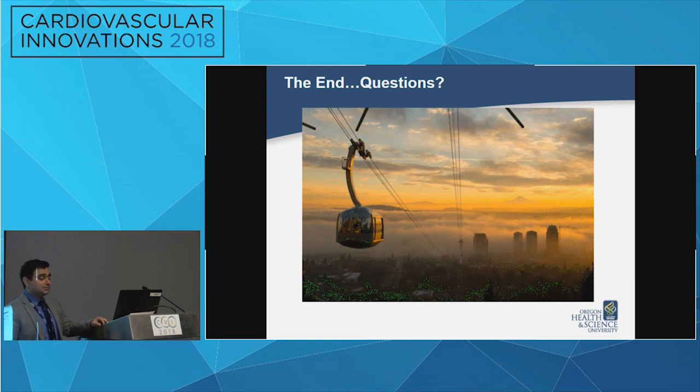These are really challenging cases. If I wrote this down correctly, you had an area of 930, I think, and a perimeter of 109, right? Yeah. So your 34 is actually not oversized at all. It's 0%. It's undersized, right? So it's really challenging because you have no valve. You can do 10 cc's extra on your 29. The engineers say it should work because of the calcification. It's really challenging.